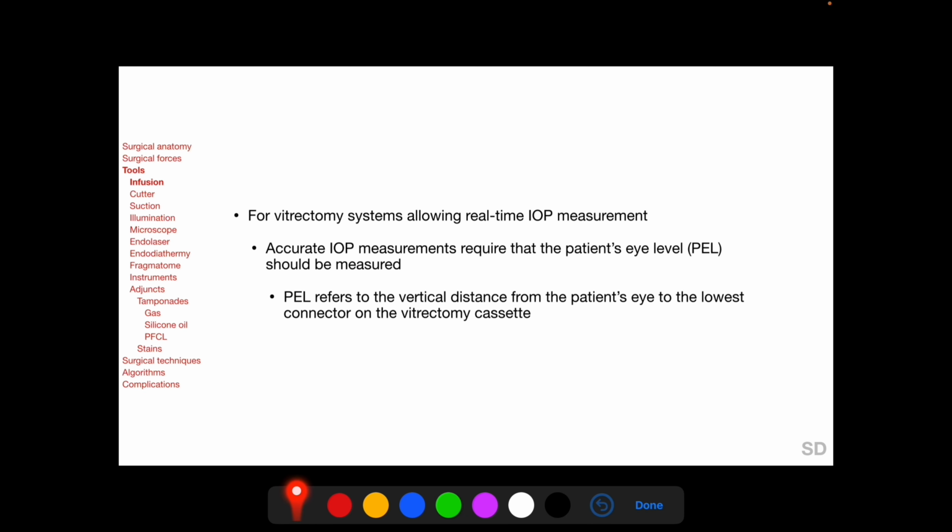Like a phacoemulsifier, a Fragmatome also uses ultrasound but to emulsify nuclear fragments of crystalline lens dislocated in the vitreous cavity. Fragmatomes require larger sclerotomies, typically 20G sclerotomy, but 23G fragmatomes are also available, and the needle of a fragmatome is slightly longer than the needle of a phacoemulsifier.